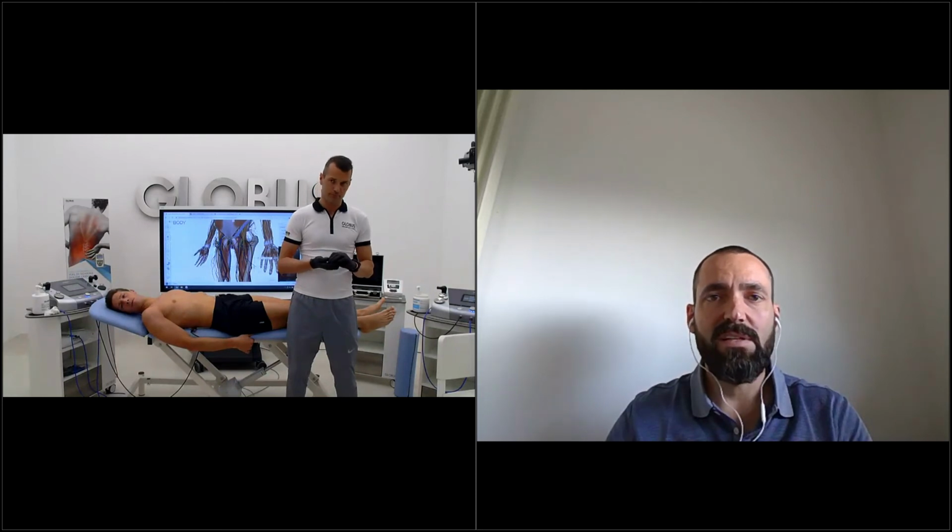About the proximal hamstring insertion, I have good results combining TECAR and fascia tools to decrease the tension in the tendon or the muscle. When we have a kind of tenoperiostitis, insertional at the ischial tuberosity, we have pain not only in the muscle and tendon but in the bone.